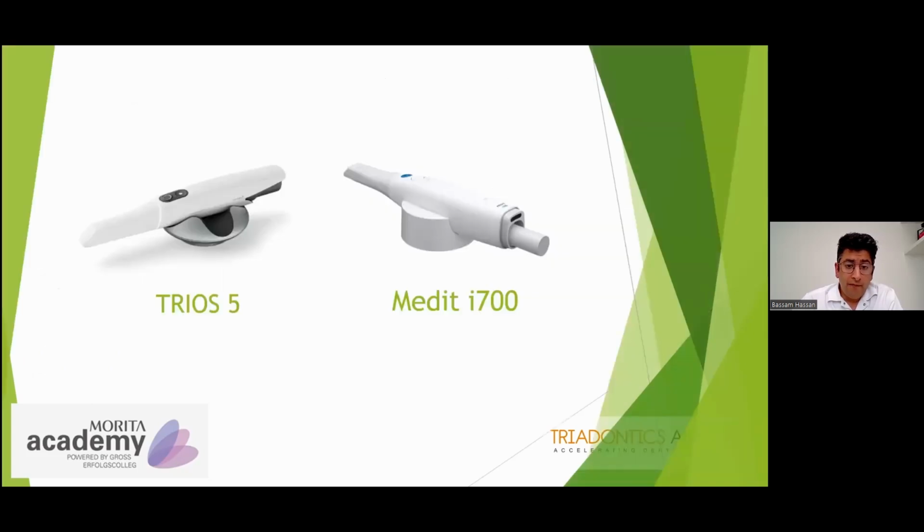So like I said, when it comes to scanning, those are the two scanners that we are working with in the practice, the Trios 5 from 3Shape and the Medit i700. For many years, I preferred to work with the Medit scanner because the workflow was completely open. I could add additional scans, I could reverse the scans, combine with impressions, a very open workflow.